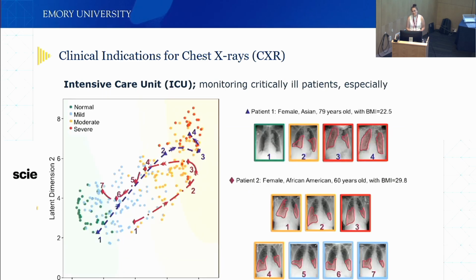So what we've done, this is some of our own work during COVID, is track x-rays over their ICU stay. For example, patient 1 came in, had very mild disease and progressed, got worse over days and passed away, had 4 x-rays done. And then we had 1 patient who came in with mild symptoms, got really bad, and then recovered. So we tried to track that and see what happens at these points where patients recover, or what happened that these patients die, and can we predict the next phase in their x-ray?